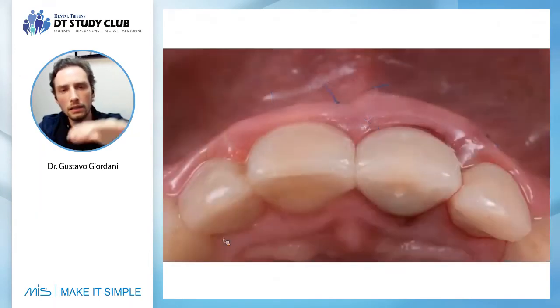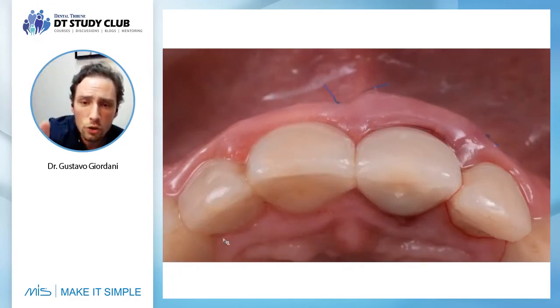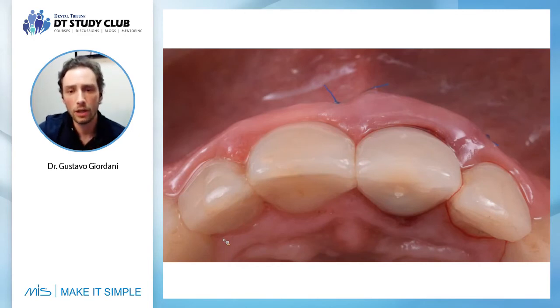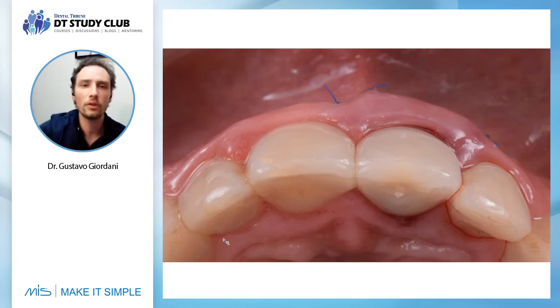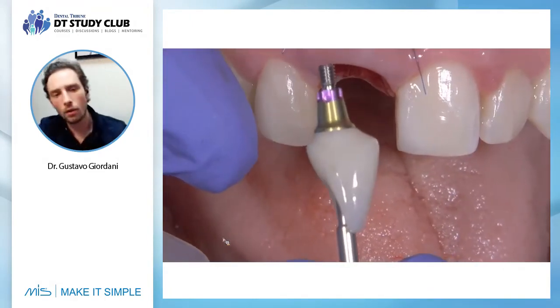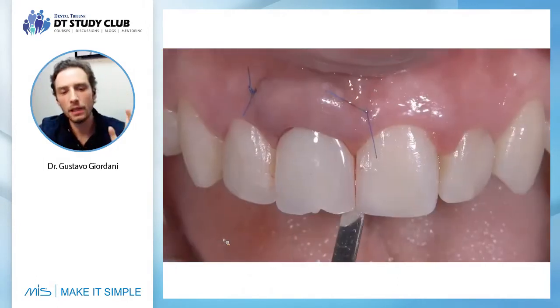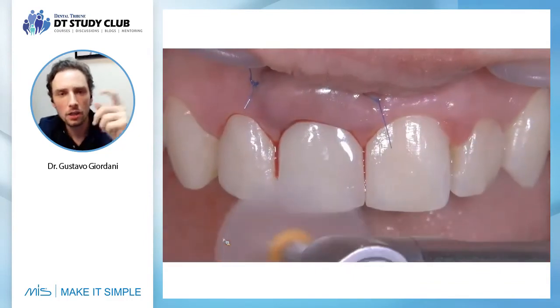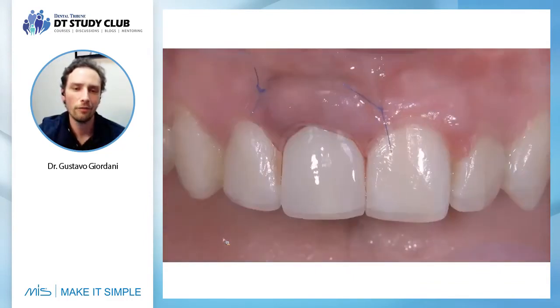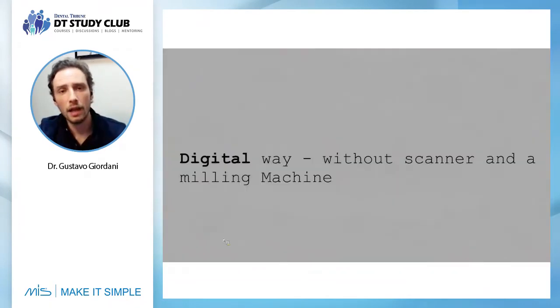Not only in this buccal field, but also from the occlusal field. So now we're gonna support the tissue in a very good way. We're gonna support the tissue in the best way to have a very good emergence profile and healing for the tissue. So after 1 hour and 30 minutes, our lab in Dentcoff will deliver the restoration. They will mill in PMMA, and we're gonna just screw inside the mouth of Monica's case.